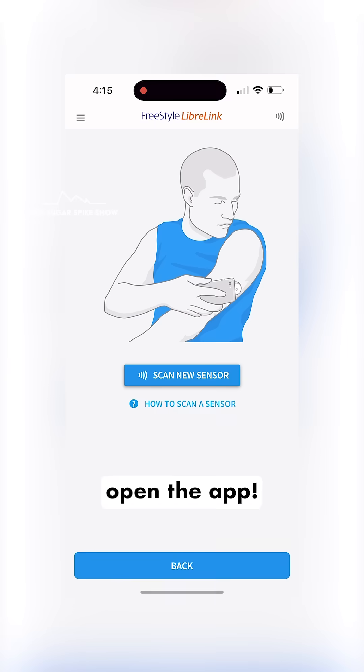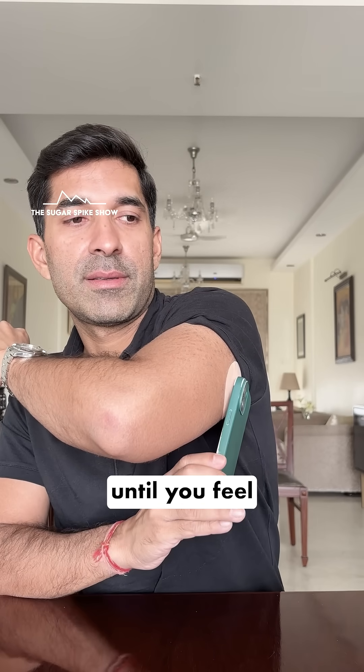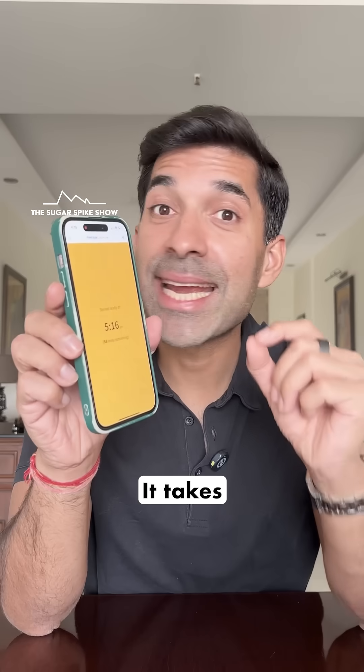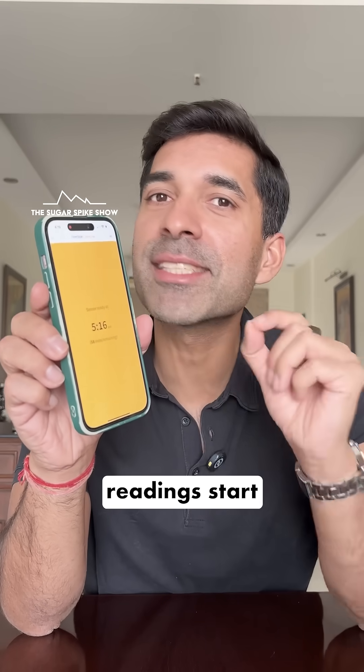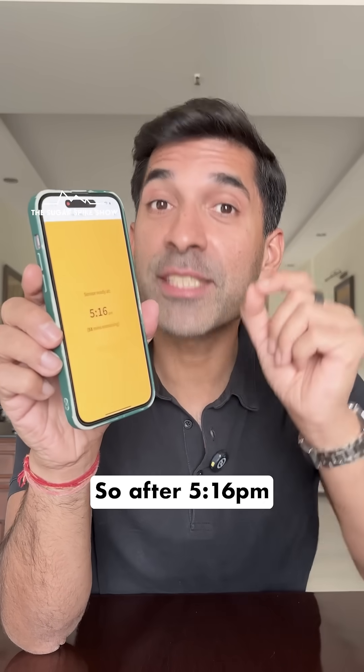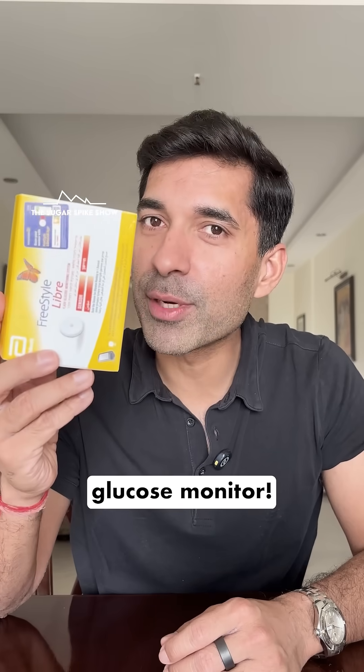This is what it looks like once you open the app. You can press the scan new sensor button and then tap the top of your phone on the sensor until you feel a vibration. It takes one hour for the sensor to get warmed up, and only after that will the reading start getting recorded. So after 5:16 PM, once I scan my sensor, my reading will start showing. And that's how you put on a glucose monitor.